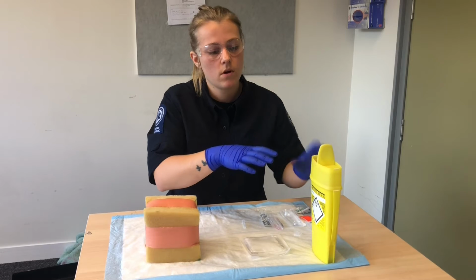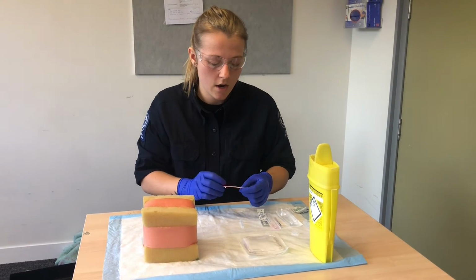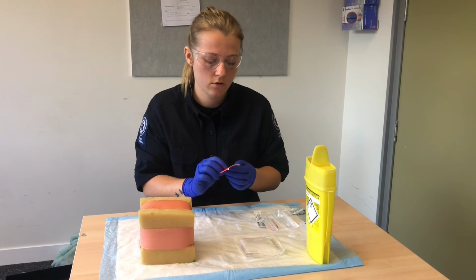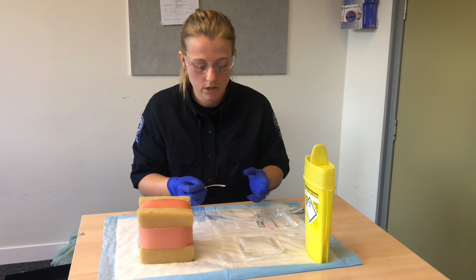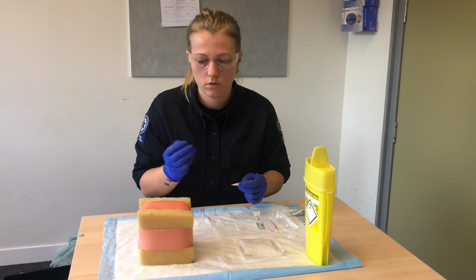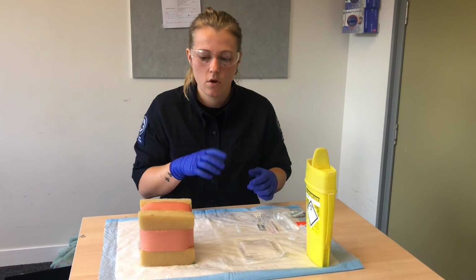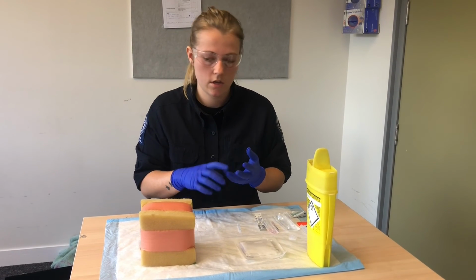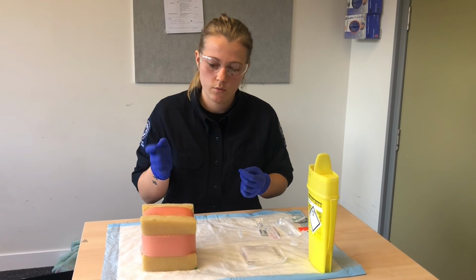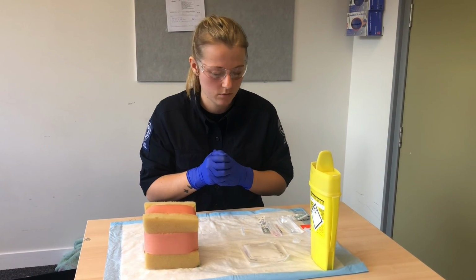I used all my lignocaine in my syringe, but if I didn't, I could put a sticker on the syringe and just say what drug it is, what amount it is, and so I could use it again. And also I want to write down what drug, when I used it, so the time and where I used it and the amount, and put it in my patient report form.